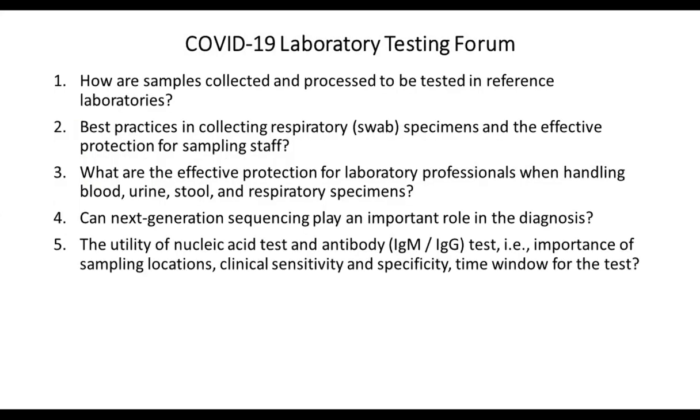I see, Dr. Jiang. So just very quickly, I think it means you didn't see a higher clinical specificity or clinical sensitivity using next generation sequencing compared to PCR. No. The sensitivity and the specificity are good for NGS, but the time is too long and the cost is not suitable for daily detection. And I think that RT-PCR is much more suitable for daily detection of large numbers of samples. I see. So next-gen sequencing is not superior in terms of clinical utility. It's much more like a research tool or investigation tool, but not a daily used diagnostic tool. Okay, I see that. Thank you so much for answering this question. I think it's very valuable input.